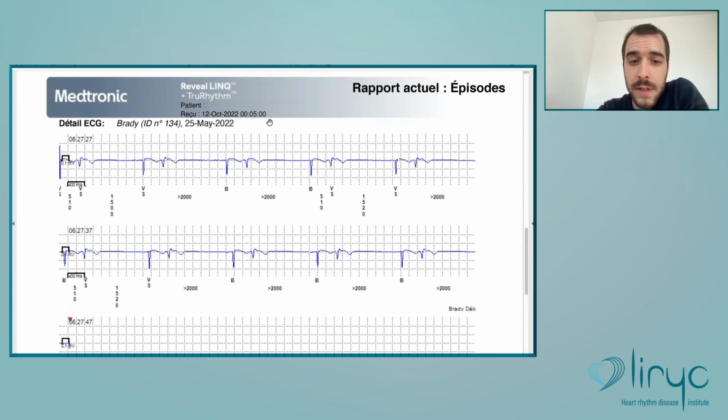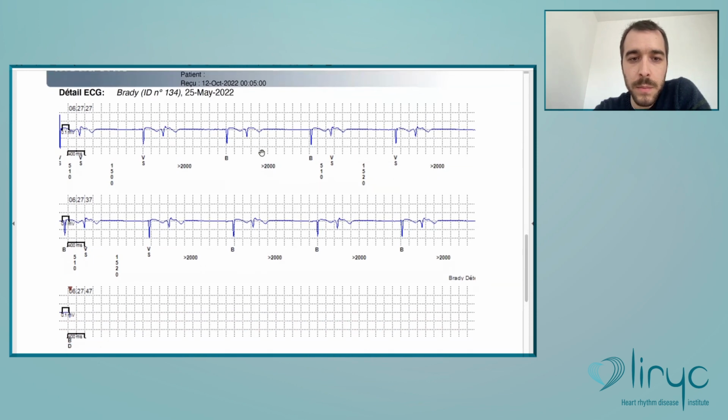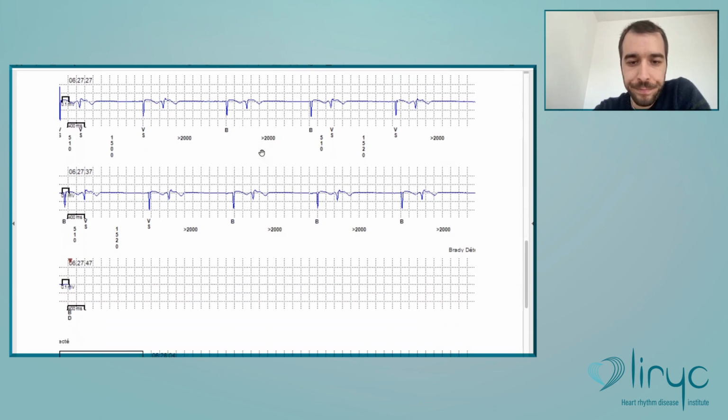This is quite frequent PVC undersensing, but it has been improved on the Link 2 platform with smart filtering and a PVC detection algorithm. Still, it's a false positive that we see quite often. We're expecting improvements with the newer platform. Hopefully on the Link 3, it will be a bit better.